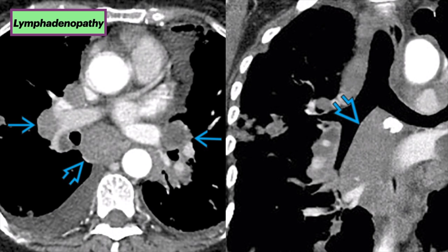This is a case of lymphadenopathy. The axial CT of this patient with lymphoma shows extensive mediastinal and hilar lymphadenopathy. A large right peri-esophageal lymph node produces an abnormal convexity of the azagoesophageal recess. Note the small bilateral pleural effusions and multiple pulmonary nodules. The coronal CT on the right shows marked coalescent mediastinal lymphadenopathy involving subcarinal and peri-esophageal lymph nodes.